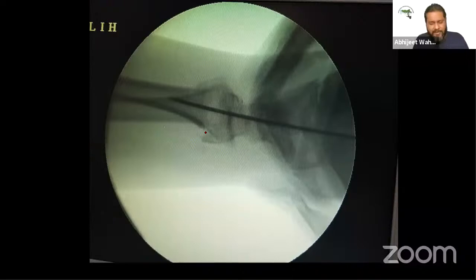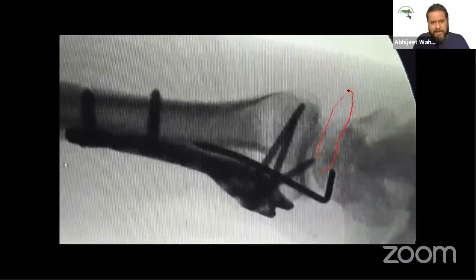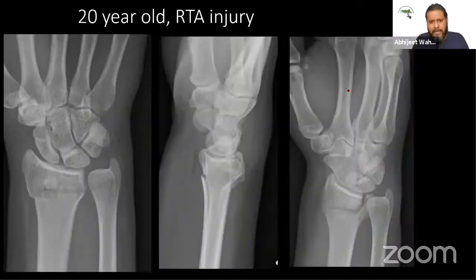The DRUJ was still unstable, so we did an open TFCC repair, and this is the lateral view, and this is the posterior anterior view to highlight the articular surface reduction. What we should be looking for are the two rims of the distal radius, which can be seen distinctly, the dorsal and the volar, and that would give us an indication about the articular alignment. Although this was not an articular fracture as such, this is something that you should keep in mind. And this patient went on to have a reasonably good outcome.